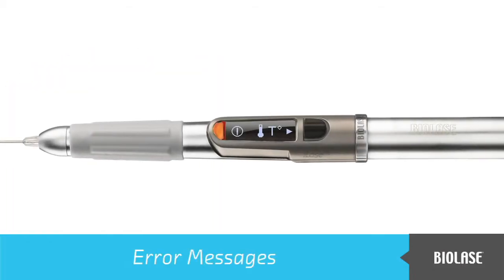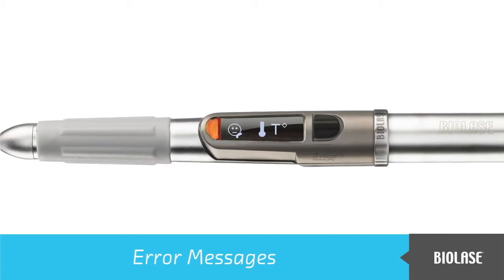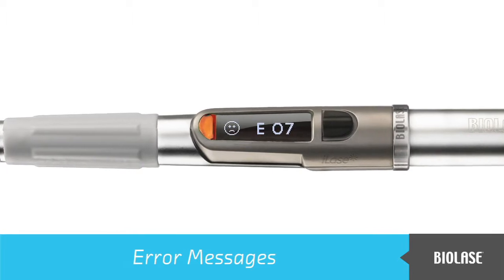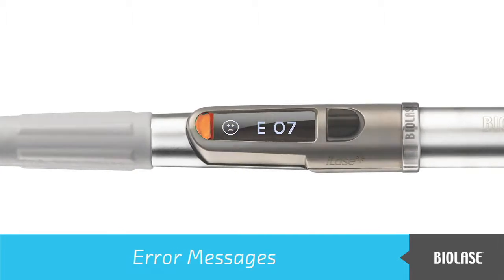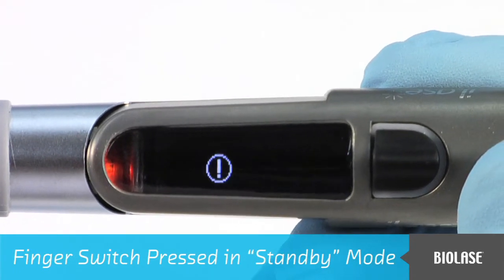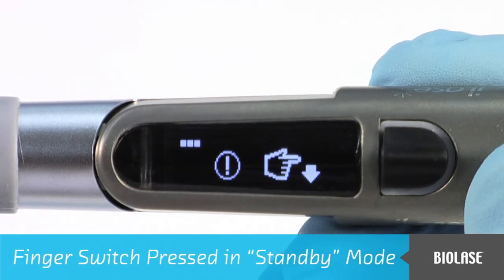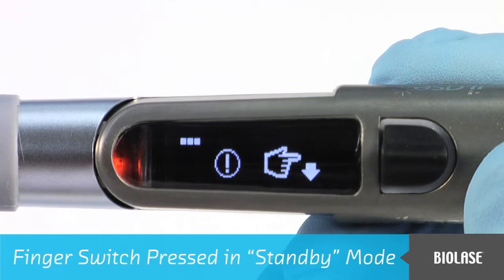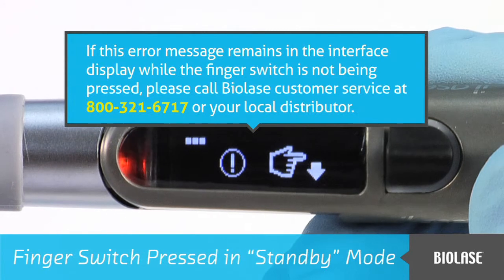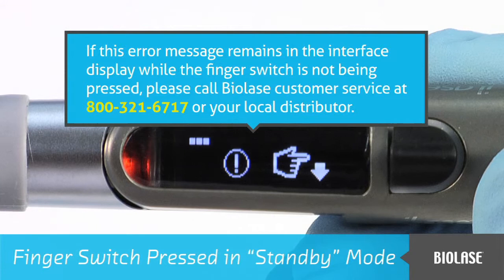From time to time, the iLase interface display may show an error message. Presented here are some suggested actions if an error message appears. For further details, please refer to your iLase user manual. If the finger switch is pressed while the system is in standby mode, you will see these symbols in the interface display. Releasing the finger switch will return the iLase back to normal operation. If this error message remains in the interface display while the finger switch is not being pressed, please call Biolase customer service or your local distributor.